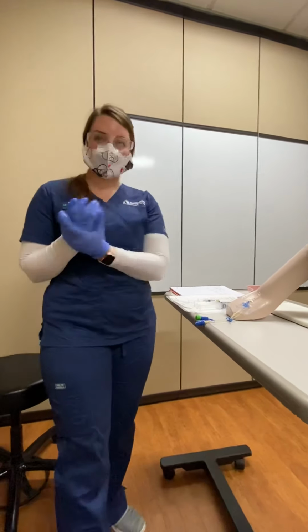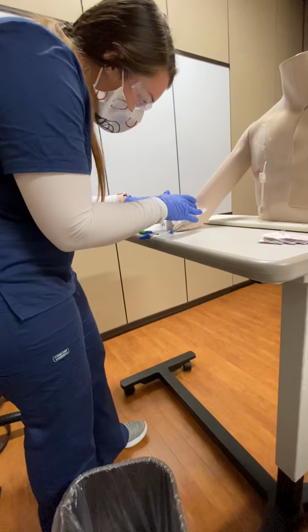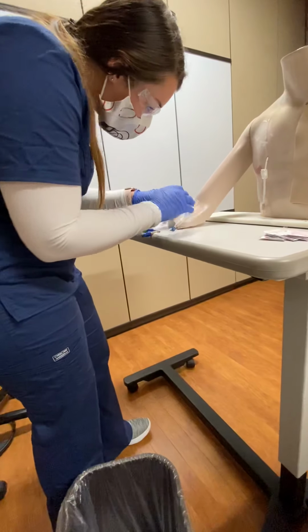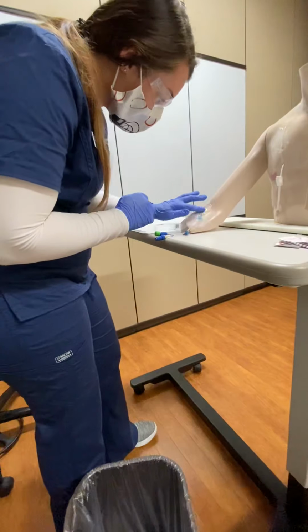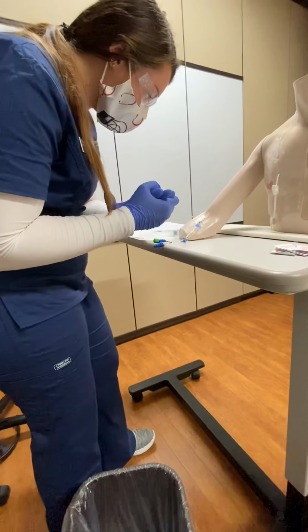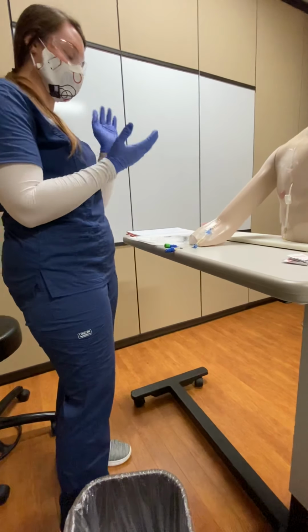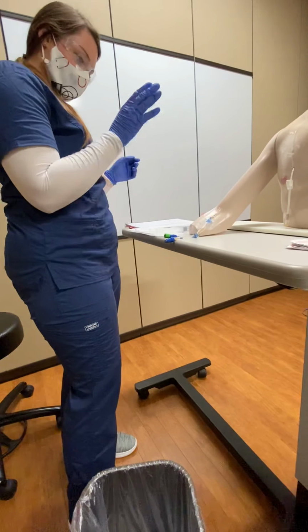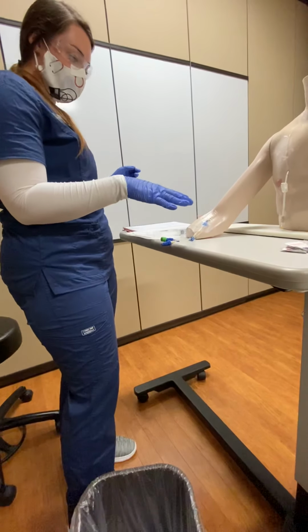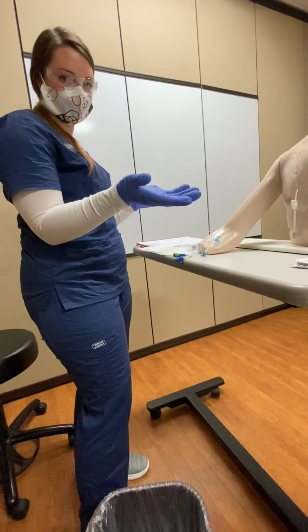All right, so now I will wash my hands, apply gloves. I'm going to take a look at the site, make sure there's no swelling, redness, any pain or anything like that. It looks good. All right, I'm going to take off my gloves, wash my hands. I'm going to put back on my gloves. She needs to keep her central line because of her long-term IV antibiotic therapy.